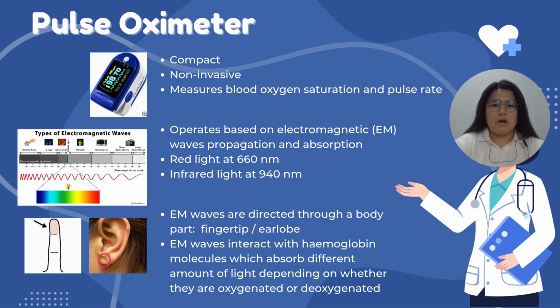The biomedical device we chose is the pulse oximeter. A pulse oximeter is a compact, non-invasive medical device that measures blood oxygen saturation and pulse rate. It operates based on electromagnetic wave propagation and absorption.